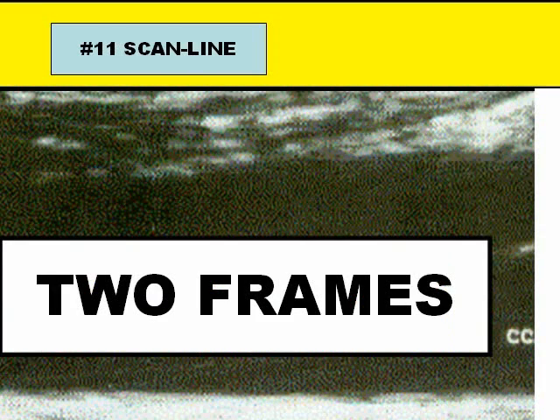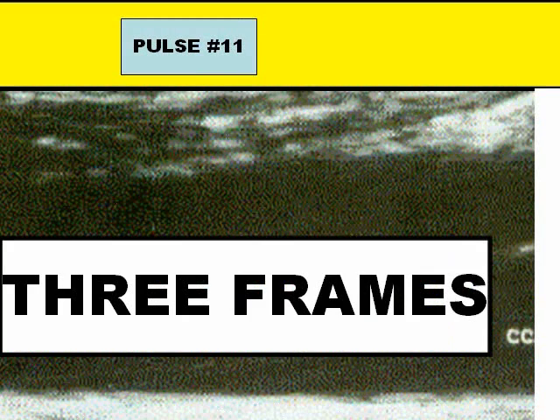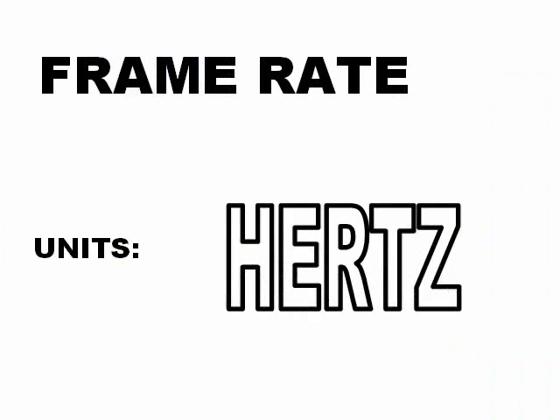Each line is one pulse. Two frames. Each line is 1 pulse. Three frames.